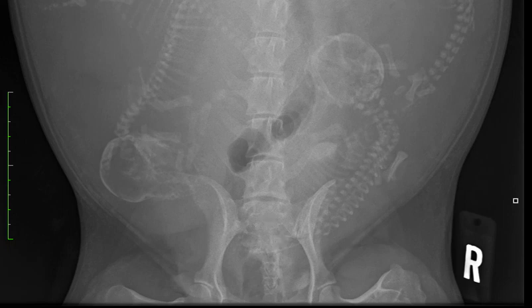So in this case, we can conclude that there are several puppies left to be born, certainly more than 3. The one that's closest to the pelvic canal is presenting with its pelvis first and may have at least one hind limb cranially, which can result in difficult delivery. So consideration could be given to next steps based on clinical exam of the mother, ultrasound of the puppies if available, and could include non-invasive support or a C-section to ensure safe puppy delivery.